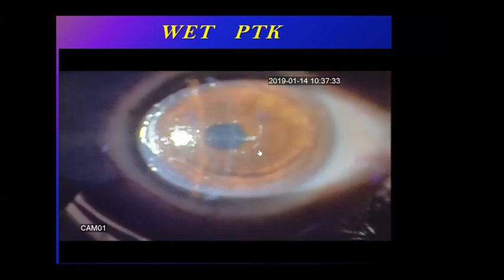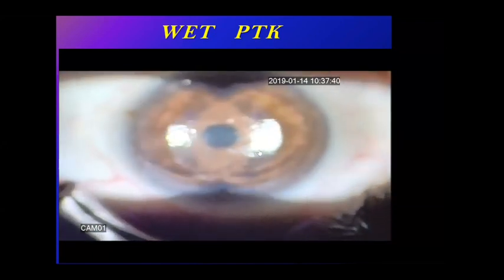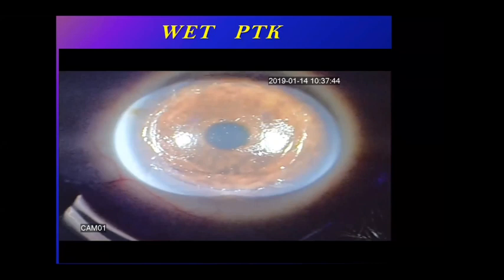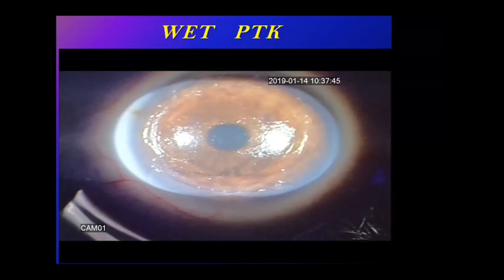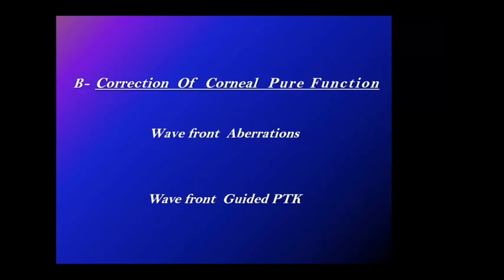And look at it. Do you remember how it looked before? How many microns, Dr. Sami? When do you feel you need to stop ablation? When you see it this way, you don't ablate the cornea, you ablate the fluid. But when you ablate, when do you stop? For example, you program 10 microns, 20 microns, or when you see something? I put it to 100, but I don't use the 100. I just use 10, putting fluids. Usually it takes less than 20, 30 microns, but on the fluid, not on the cornea. Do you see the difference? It looks beautiful. Now, this is the shape.